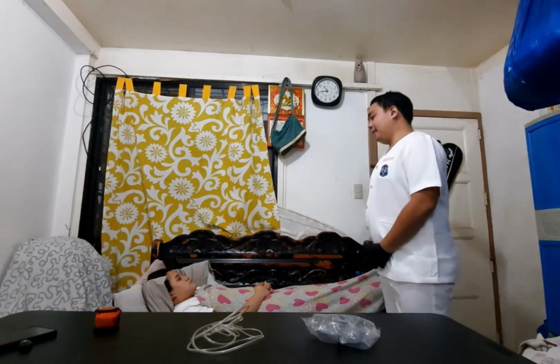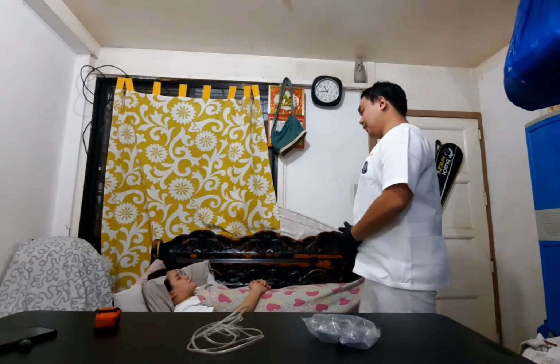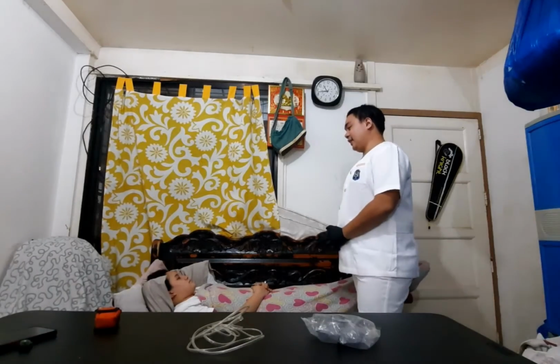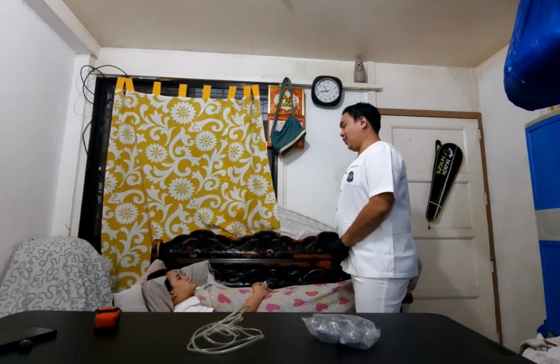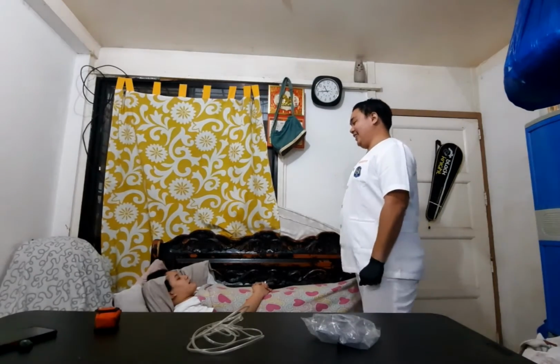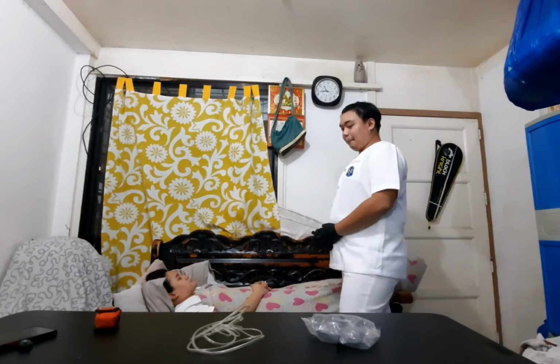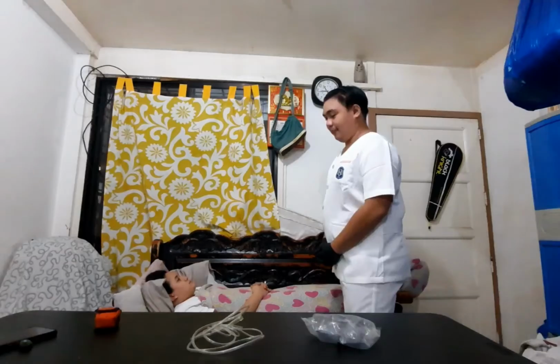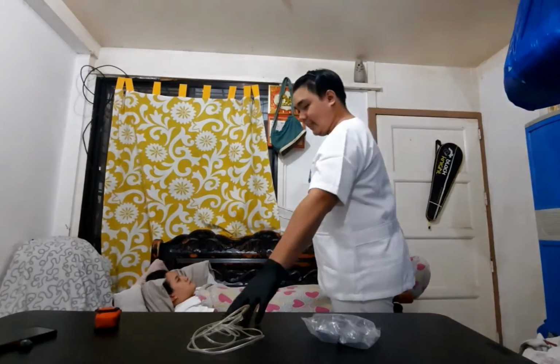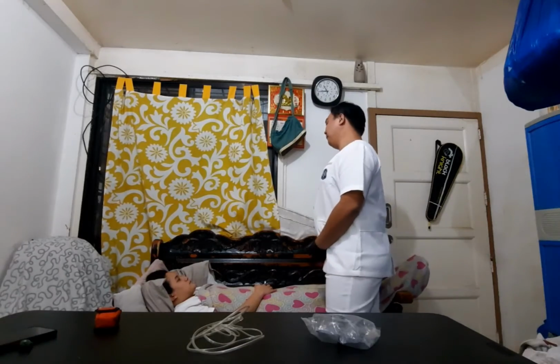Hi Miss Pam, I'm Brian Agdano, your nurse for today. And now I will be explaining the procedure of administering oxygen therapy using the nasal cannula, if it is okay with you. Yes, it's okay. So in this procedure, I will check your oxygen saturation using the pulse oximeter, and then I will be administering the nasal cannula through your nostrils. If it's okay with you, ma'am. Yes, okay.